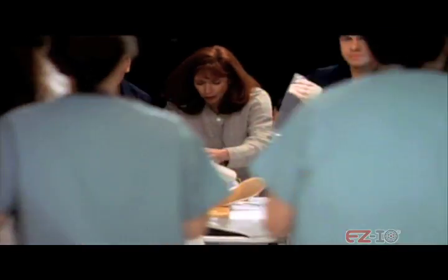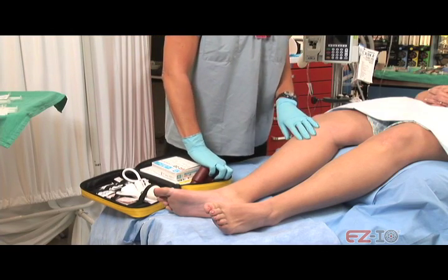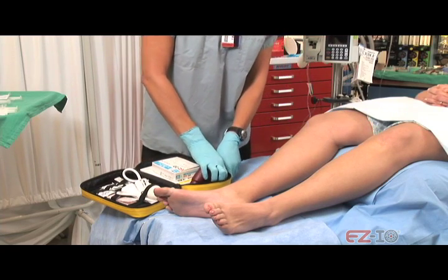Can't get a line. Somebody get me the Easy IO. Okay, I need to put a line into your leg. I'm going to put it actually into the bone. We can't get a line on you, an IV line, okay?